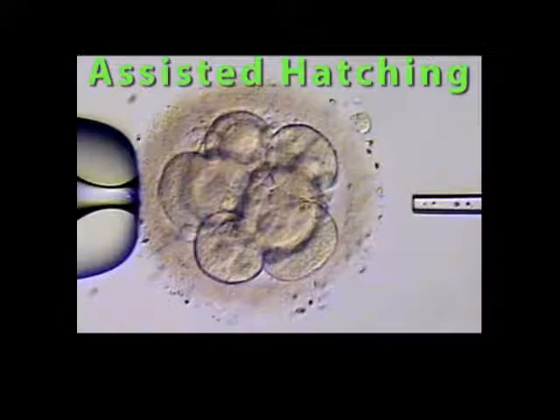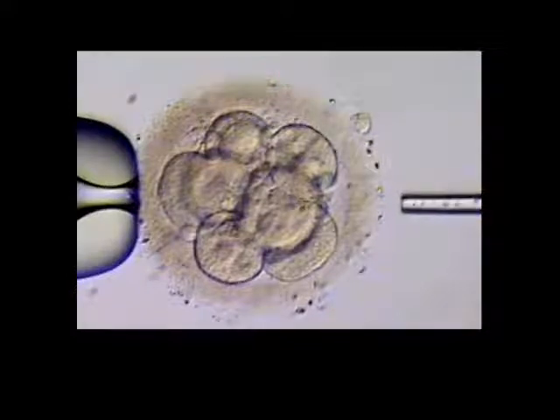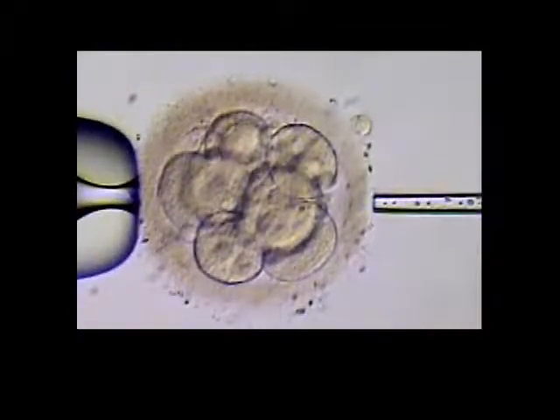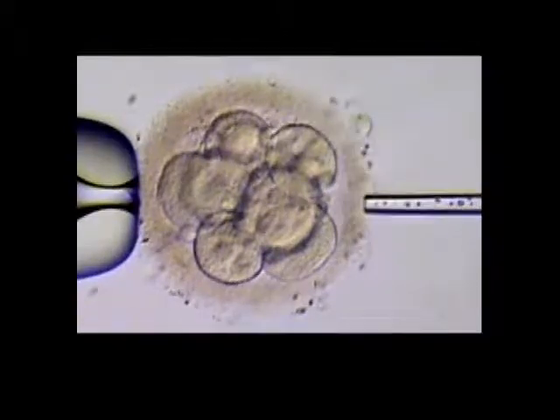This video shows assisted hatching using an acid Tyrode's solution. The holding pipette is at the left and holds the embryo steady. The hatching needle is at the right. It comes in and, using an acidic solution, we digest a hole in the shell of the embryo.